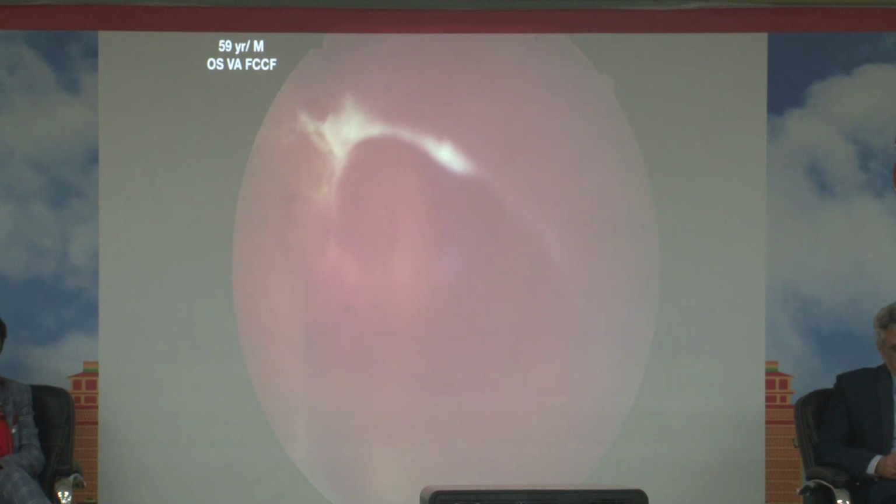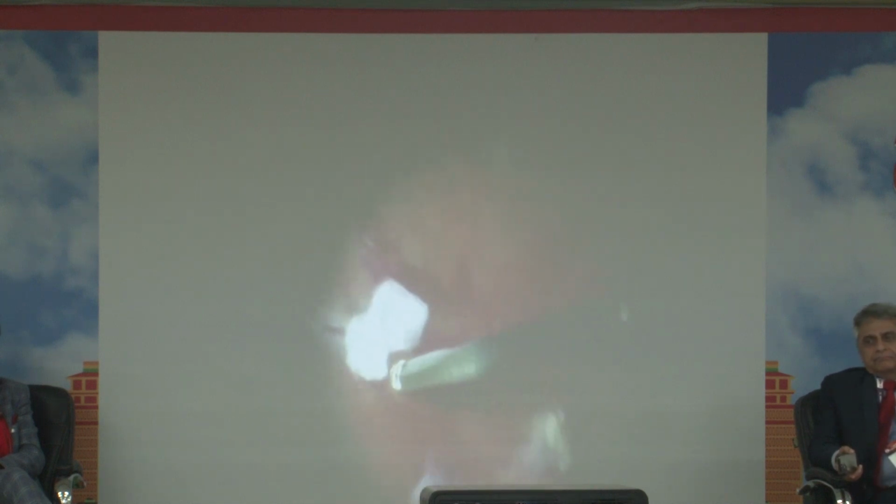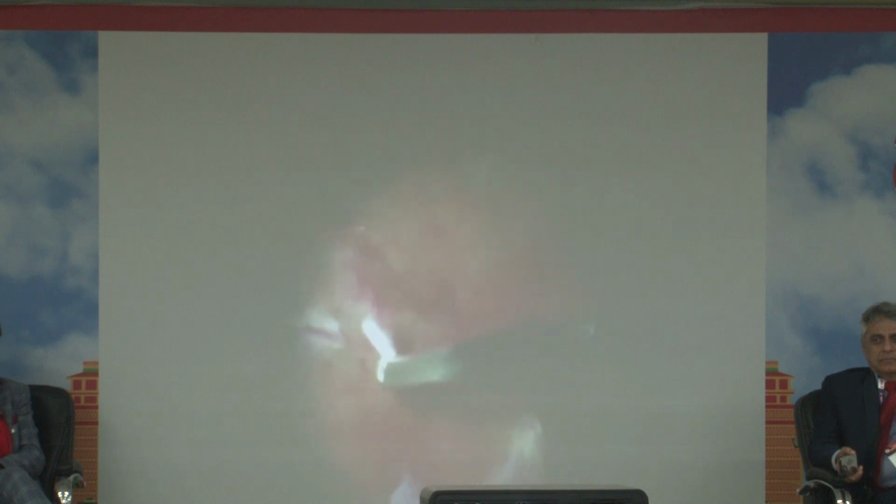Again, in patients with tractional retinal detachments, we have to do a 360-degree vitreorrhexis all around initially. Again, it's not possible in every case, but in cases where there is a subhyaloid bleed, there tends to be some amount of gap between the posterior hyaloid and the retina. So in those cases, it's easier to delineate the plane. Again, we have to do delamination and segmentation. So we try to remove the entirety of the proliferation, but first divide it into smaller parts, find out the plane, and then go for a complete removal.